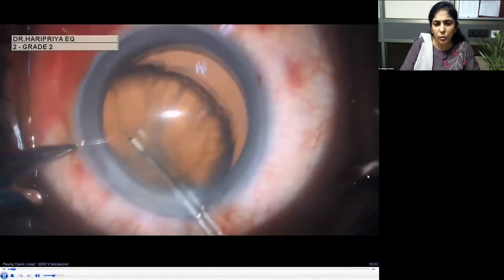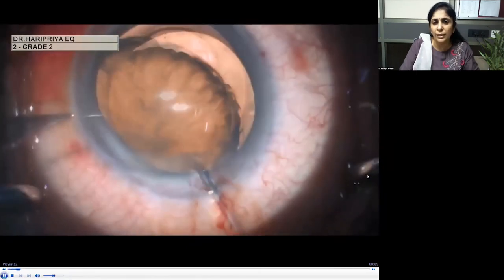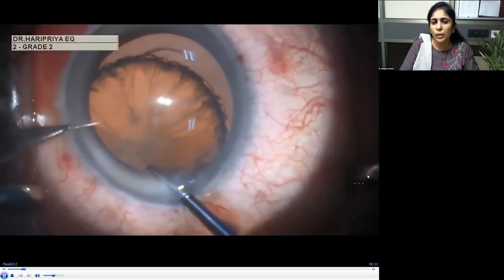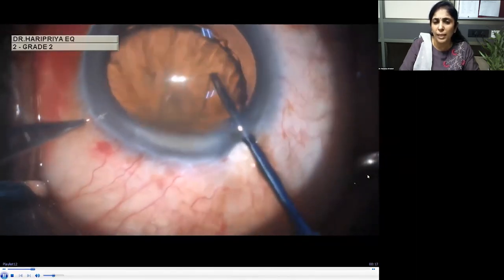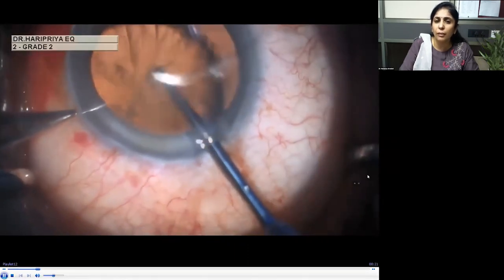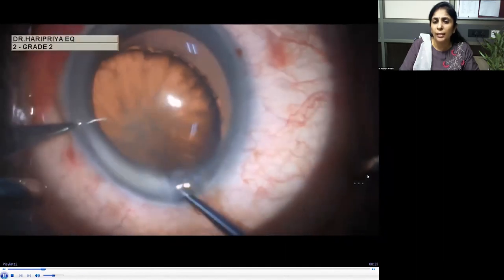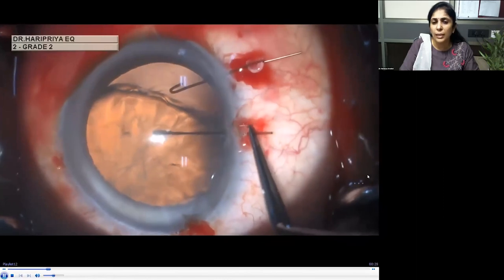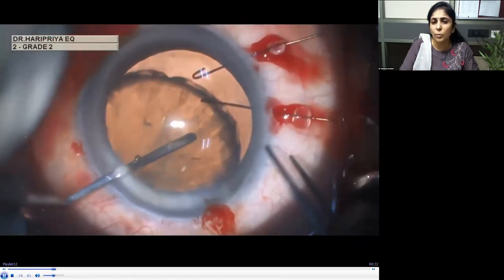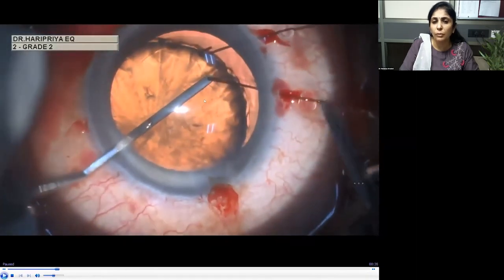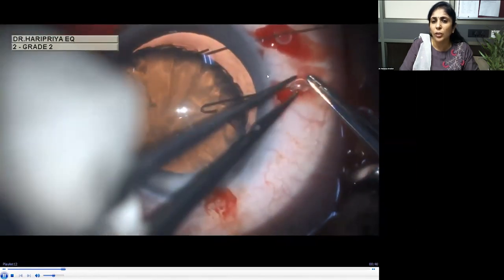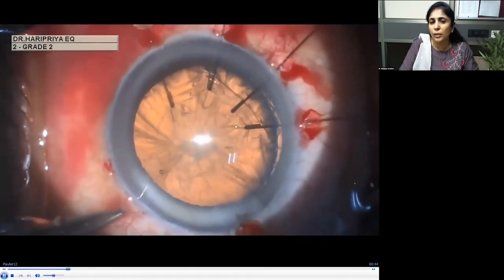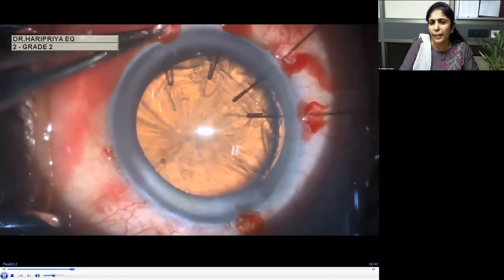This case shows a gross subluxation. Even so, with good viscoelastic you can proceed. In these eyes you must always use forceps because the zonules are very weak and have more centripetal force. Do not make the rhexis too large at the site of maximum zonular lysis. To insert the iris hook onto the rhexis margin when the lens is posterior, lift the capsular bag gently with a spatula using your non-dominant hand — it's safe because it's blunt — then place the hook to hold the rhexis margin.